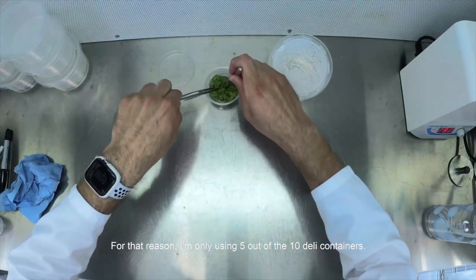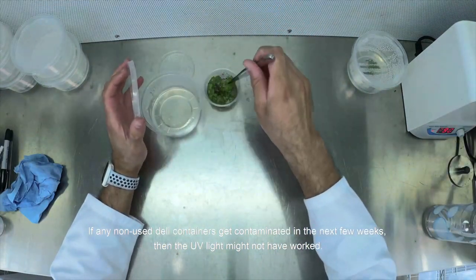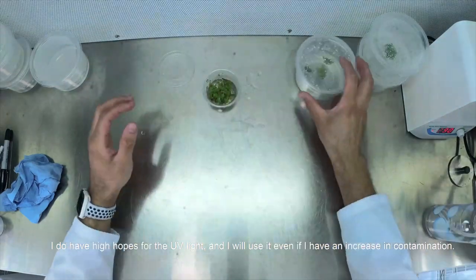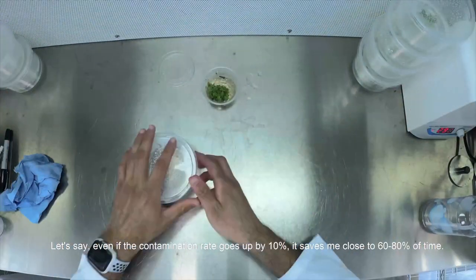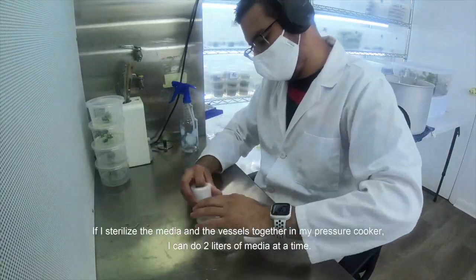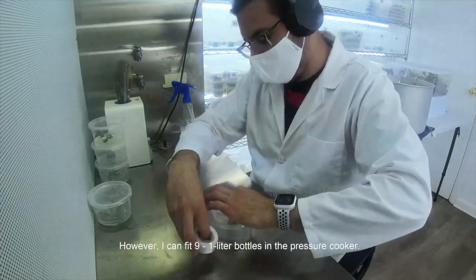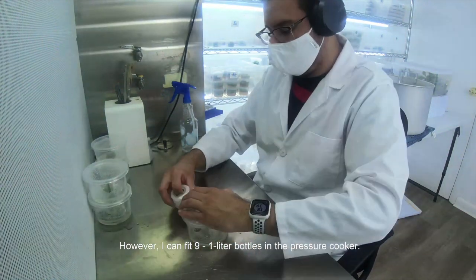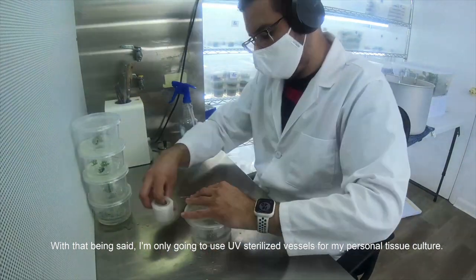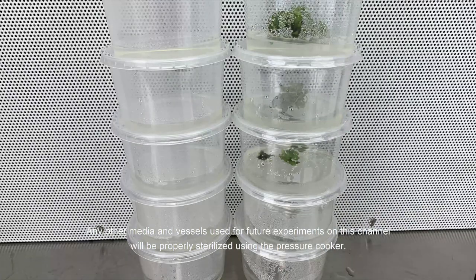For that reason, I am only using 5 out of the 10 daily containers. If any non-used daily containers get contaminated in the next few weeks, then the UV light may not have worked. I do have high hopes for the UV light, and I will use it even if I have an increase in contamination. Even if the contamination rate goes up 10%, it saves me close to 60–80% of time. I am only going to use UV sterilized vessels for my personal tissue culture. Any other media and vessels used for future experiments on this channel will be properly sterilized using the pressure cooker.